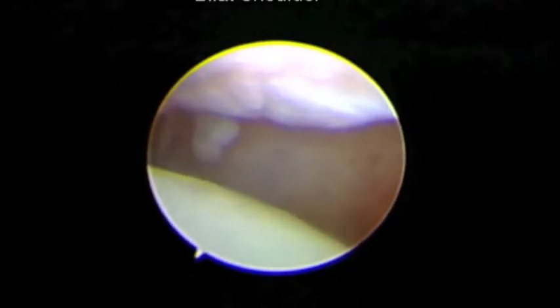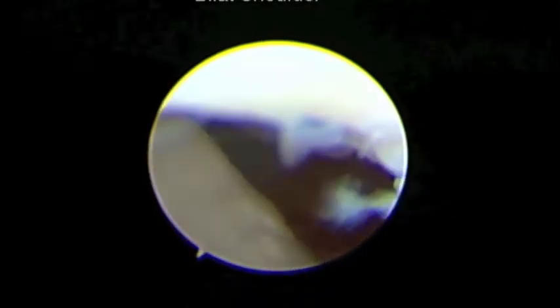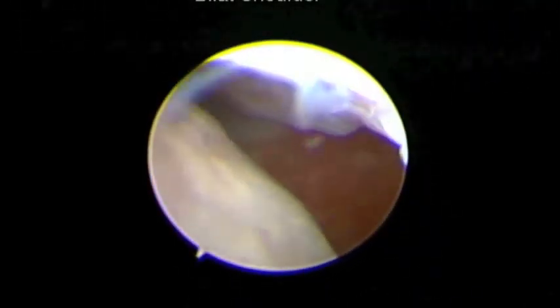Working our way back up again — there's the capsule. Look at the cartilage above here. You're going to see where the top portion from big bone spurs were catching and grinding on the back portion of the humeral head. The ball and the socket were catching against each other and just wearing and tearing. Right there you can see the abnormal contact from chronic breakdown of the shoulder.